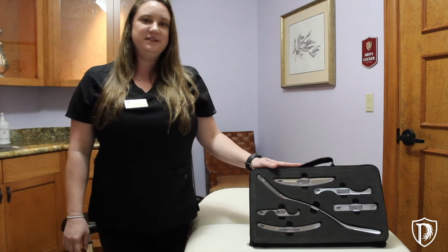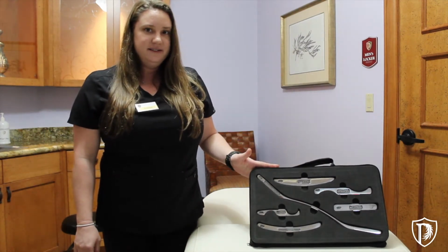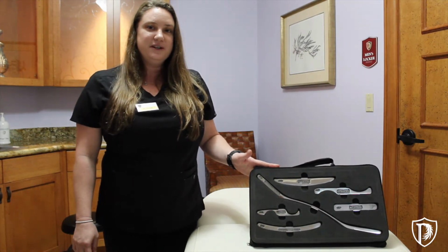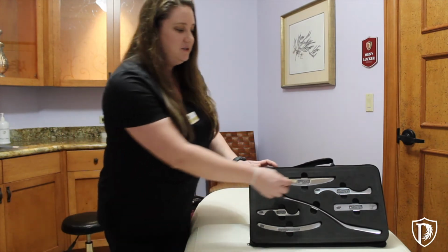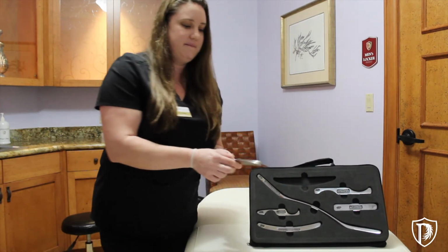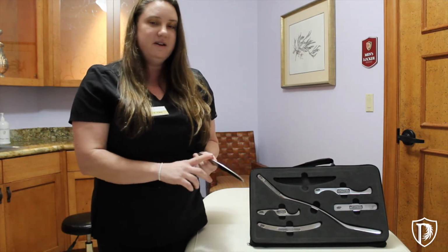So these are the instruments themselves. As you can see, they come in 6 different shapes and sizes, and that's because they're designed to contour to different parts of your body. What they all have in common though is each one of them has a bevel or smooth rounded edge. And this is actually the part of the instrument that I use to treat with.